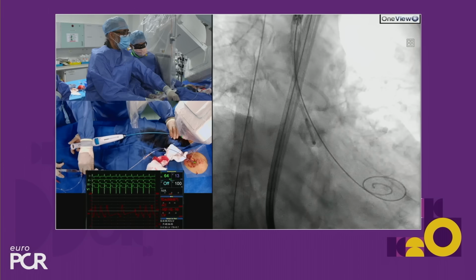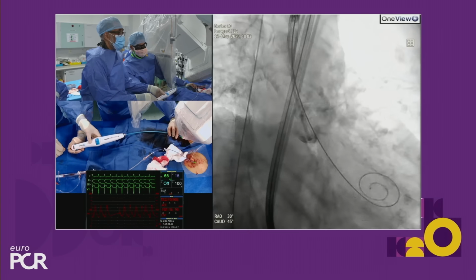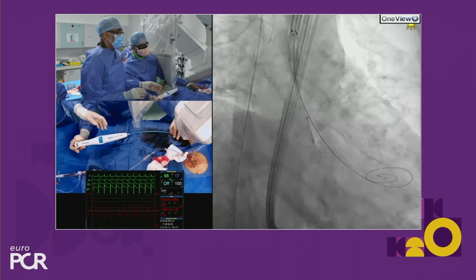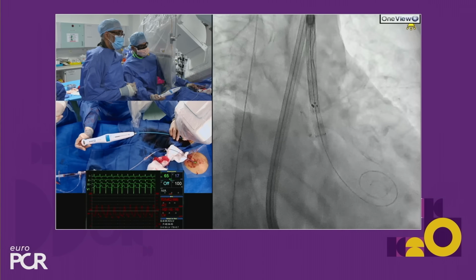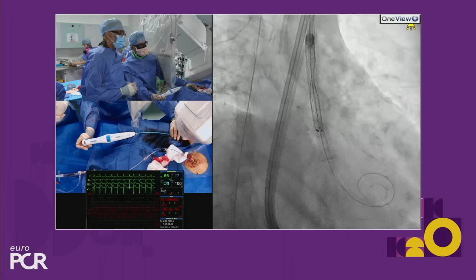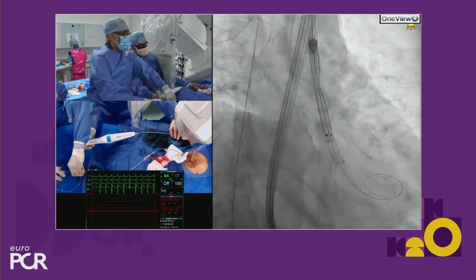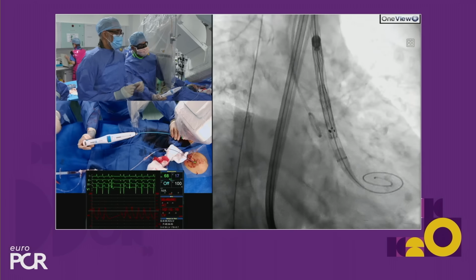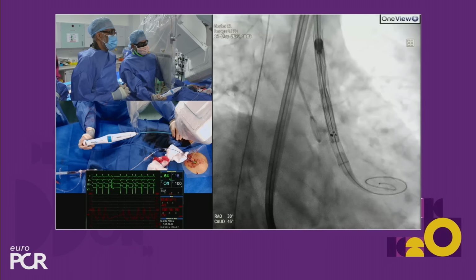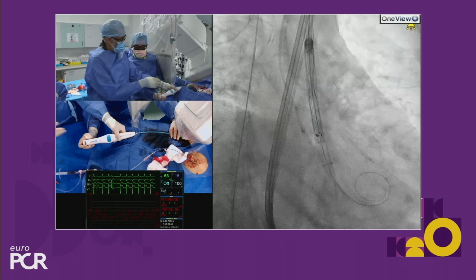Okay, fine. So we've got our line in. There's a bit of calcification to tell us where to go. And so, yep, I'm happy. So you're basically advancing it in. Neil's doing all the work here to get it through and then into the right sort of height in the cusp overlay view. So if you're happy there, Neil, shall we take a picture? Yeah. Okay, so I think that's looking good. The dots are there. Rapid pacing, yay or nay? No, I think not. I think it's a very stable valve.